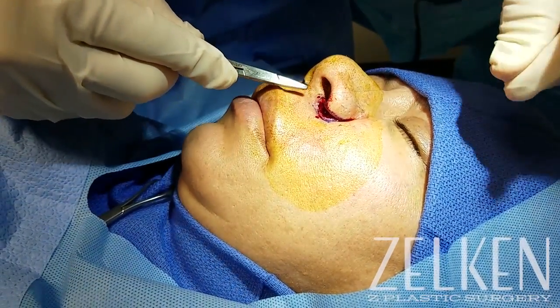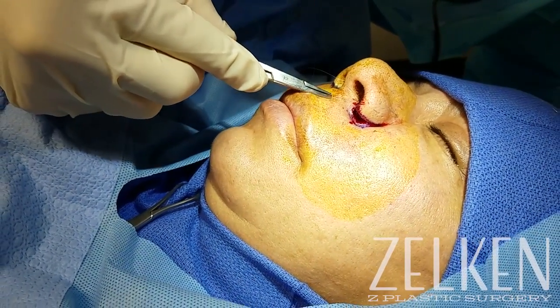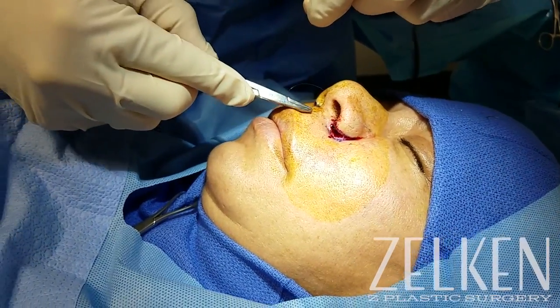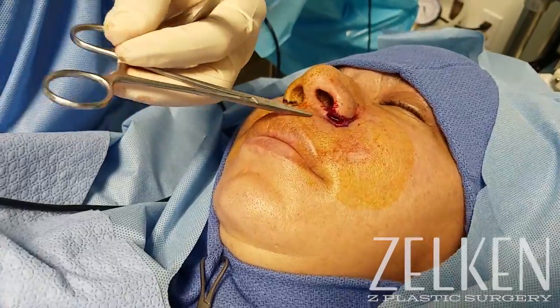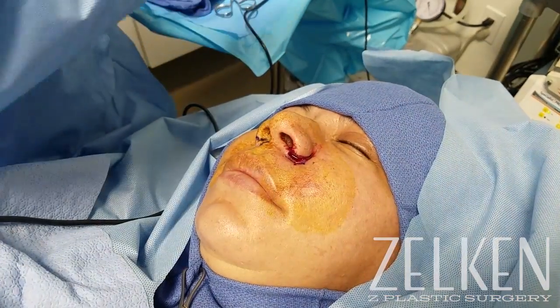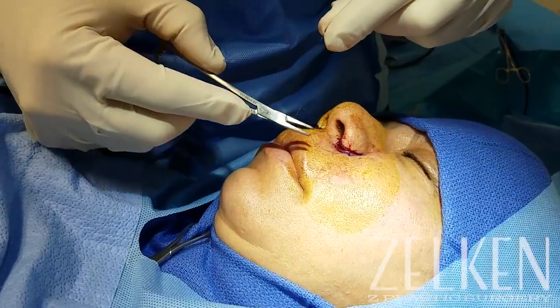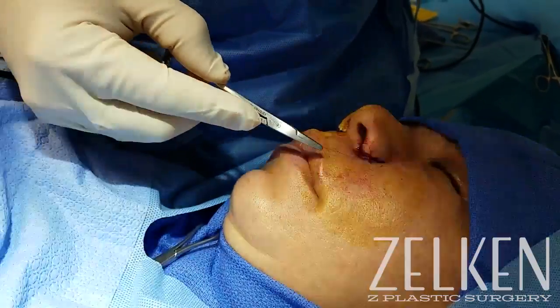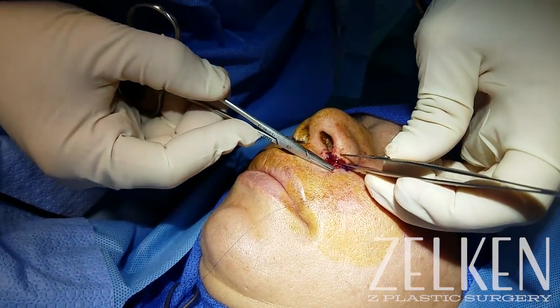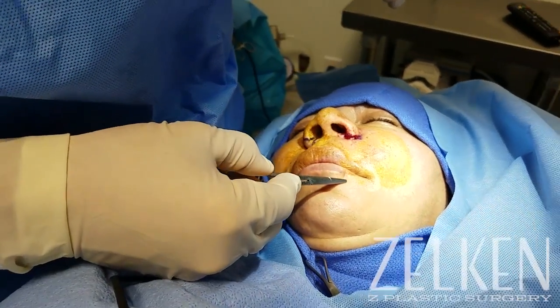I continue with a series of transdermal stitches. I do largely follow the technique as described by Cridel, but I also believe in Rod Roerick's theory that avoidance of deep stitches does avoid spitting sutures in the long term. I've seen in the past that when I place deep stitches, it does let me sleep better at night, but it does have a tendency especially in the sebaceous tissue to lead to small spitting stitches. So to avoid that, I do a ton of small transdermal sutures. I use a 6-0 prolene suture and I bisect it every time. I perform the first stitch in the nostril sill to make sure that I have perfect anatomic alignment of the fragments — that's the most important stitch. Then I bisect the difference between the cephalic incision and the sill, and keep going back and forth until the wound is entirely closed without any gapping.